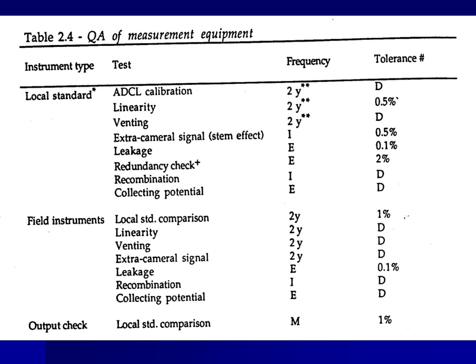And we still use it for the spine SRS, so a couple times a week. We also have all the measurement equipment that we use for machine QA. It also has its own QA, including the chambers that we use to measure the output. They need to be sent away. Well, actually, not too far. It's here. I'm so used to sending them out to Wisconsin.